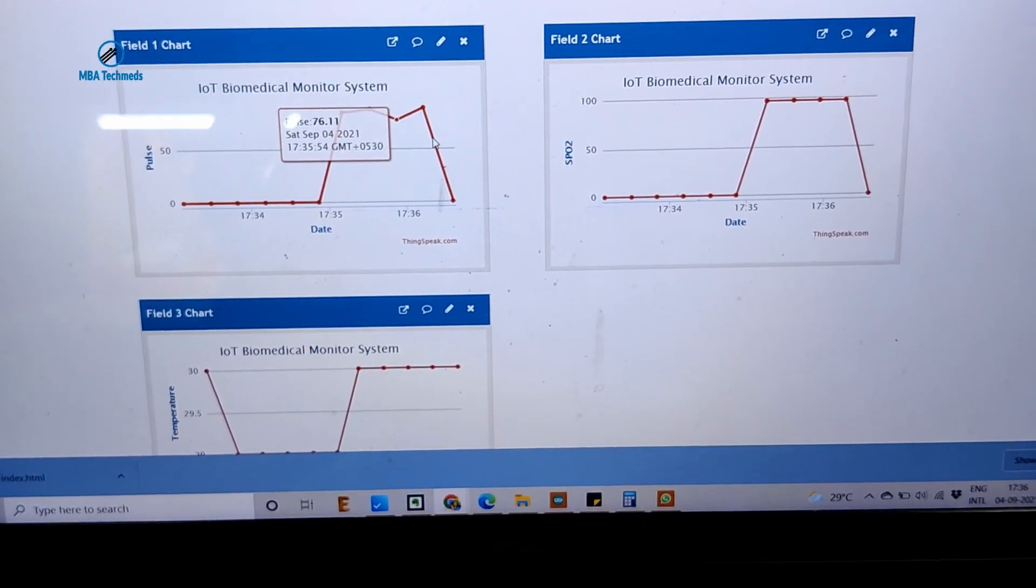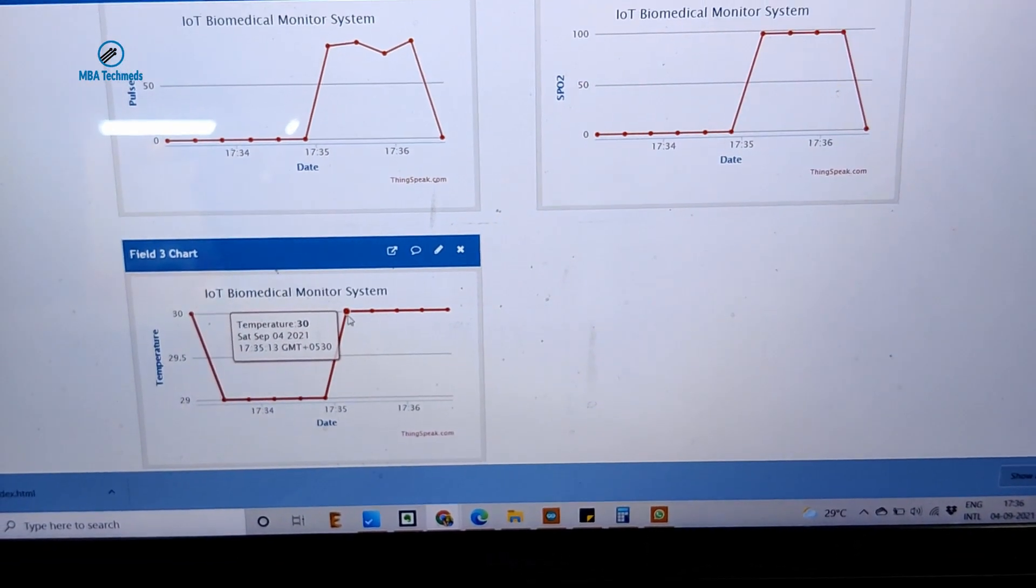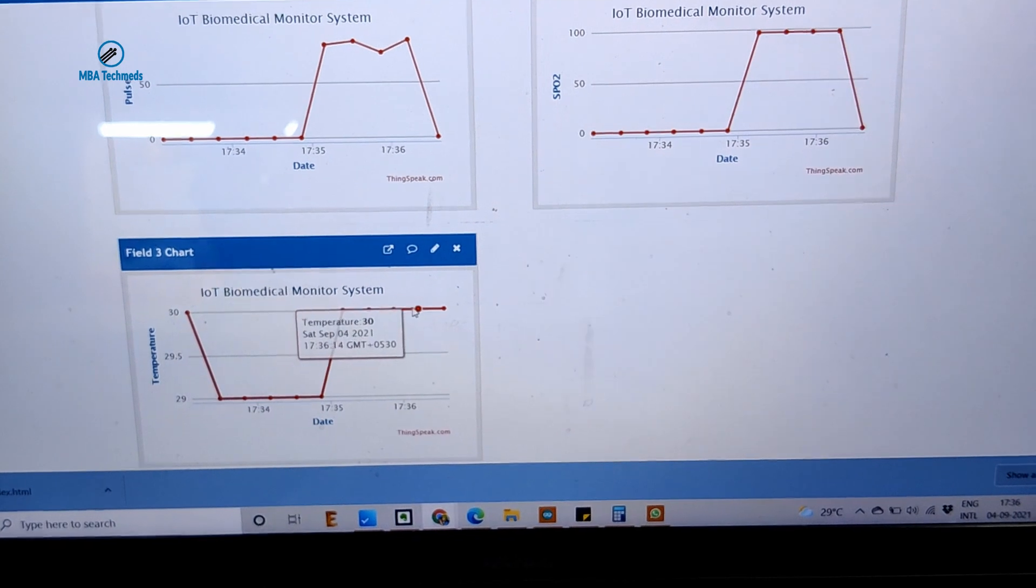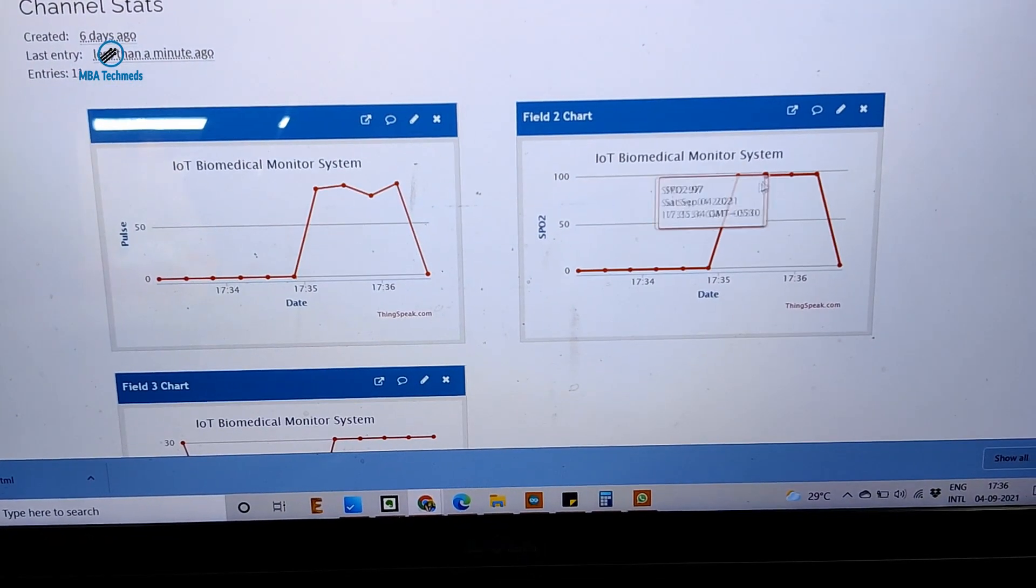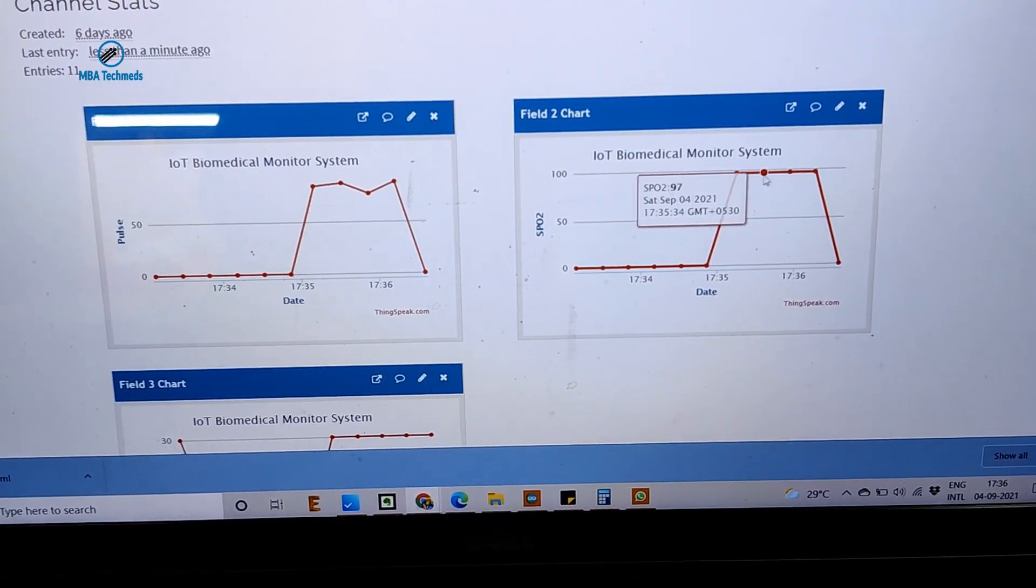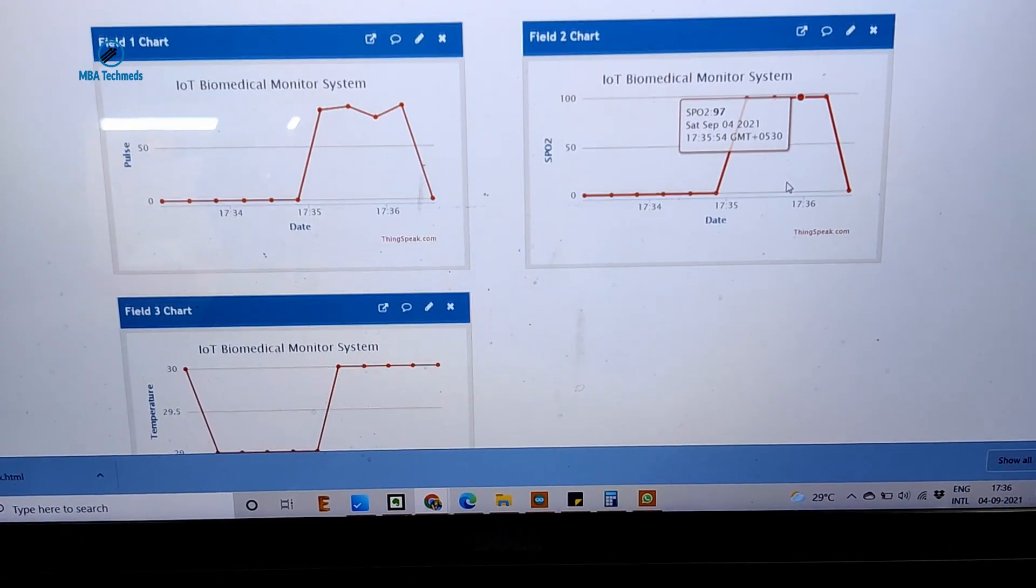Now the system is off, so the value is coming zero. Temperature value is in the 30 range and SpO2 is around 100, which is normal level.